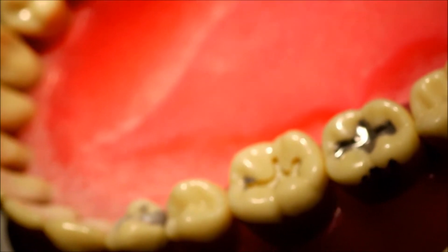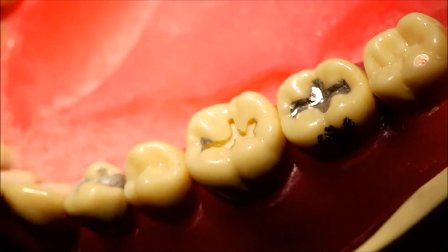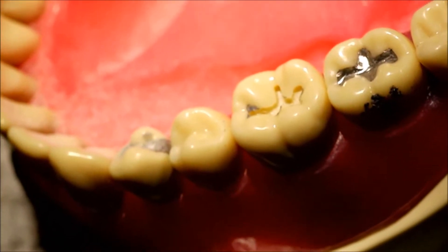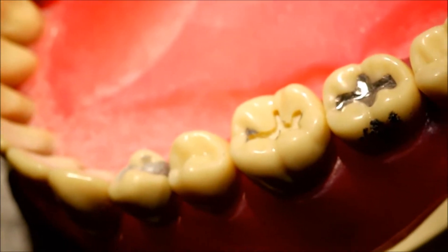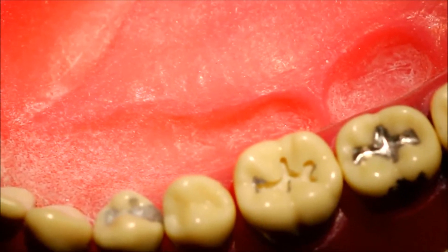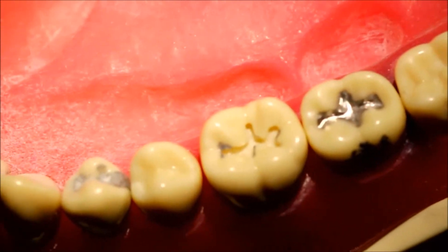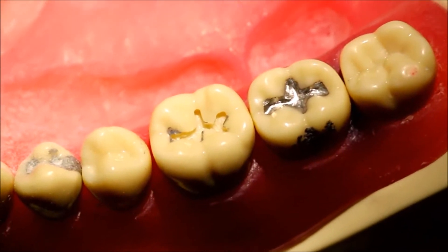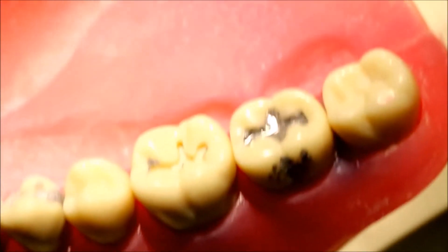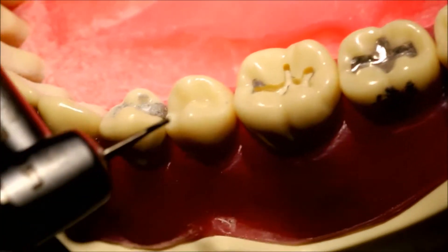The greatest thing about using the 329 burr instead of a 330 is that it is 0.6 millimeters in diameter as opposed to 0.8. This allows novices a little more flexibility in terms of mistakes. If one were to miss the groove, you could simply readjust by taking a slightly larger burr and cutting preferentially towards one side in order to reorient the extension right in the groove.